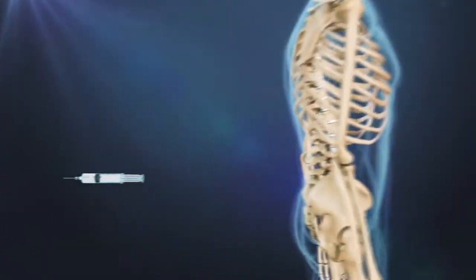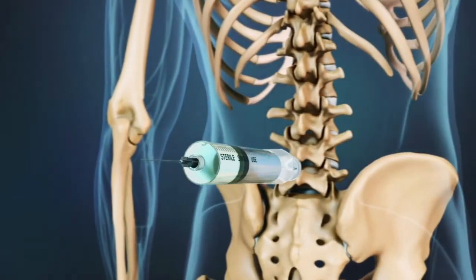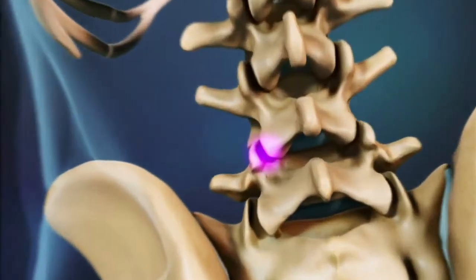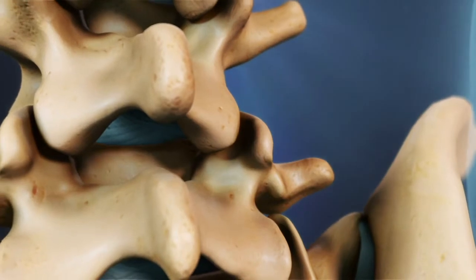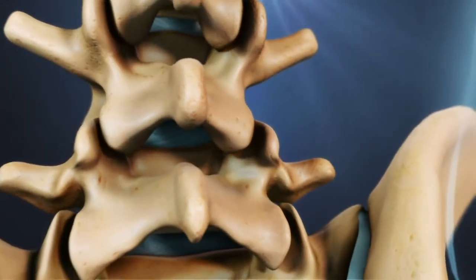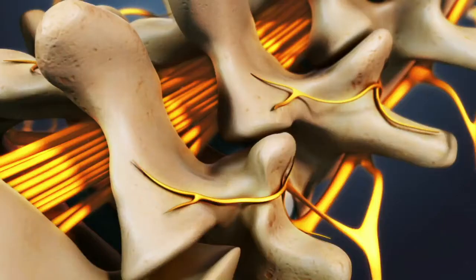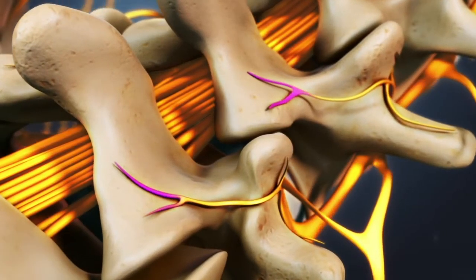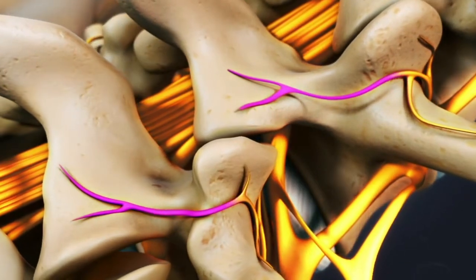A radiofrequency neurotomy is a type of injection procedure used to treat facet joint pain. Facet joints are pairs of small joints between the vertebrae and the back of the spine. The facet joints support the spine while also allowing motion in terms of bending, flexing, and twisting. Each facet joint is connected to two small medial branch nerves that carry pain signals from the facet joints to the brain.